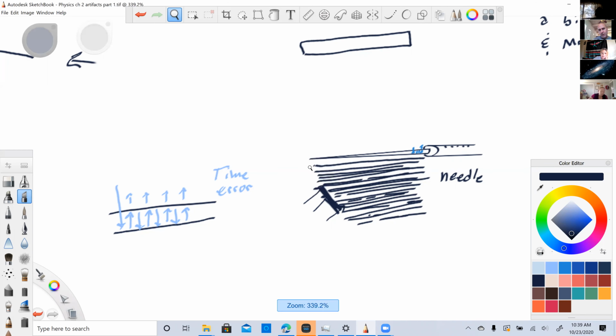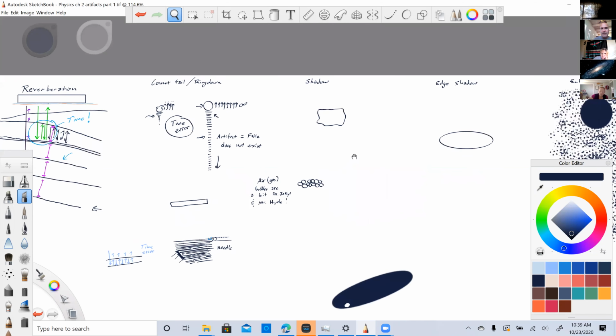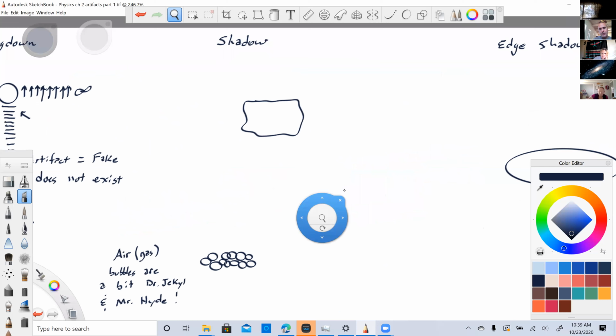Okay, now I'm done with ring down. Let's go to shadowing. A couple pictures for shadowing. Shadows are also very useful. They can be caused a number of different ways, but for the most part, it's an unusual amount of attenuation. Remember, the machine assumes it has a built-in TGC curve. If you're doing an abdomen, there's a built-in TGC curve. You can mess with the TGCs to your liking, but there's something built in with that.